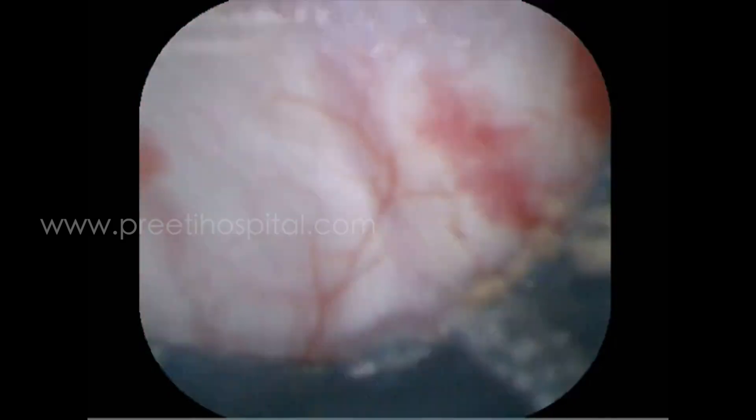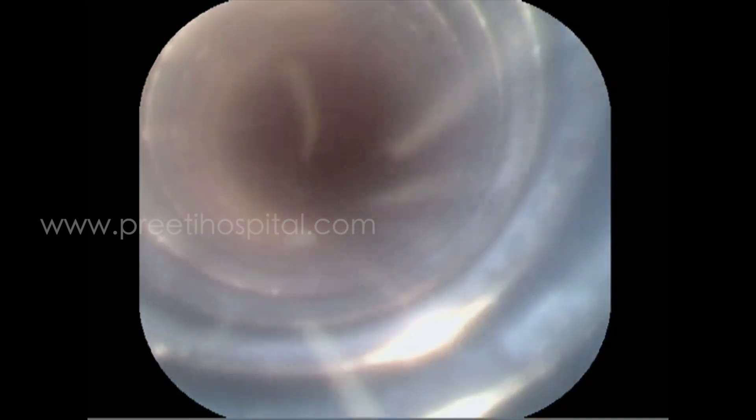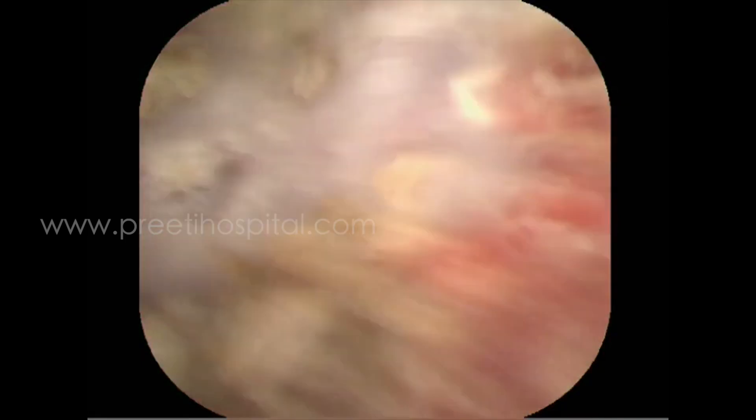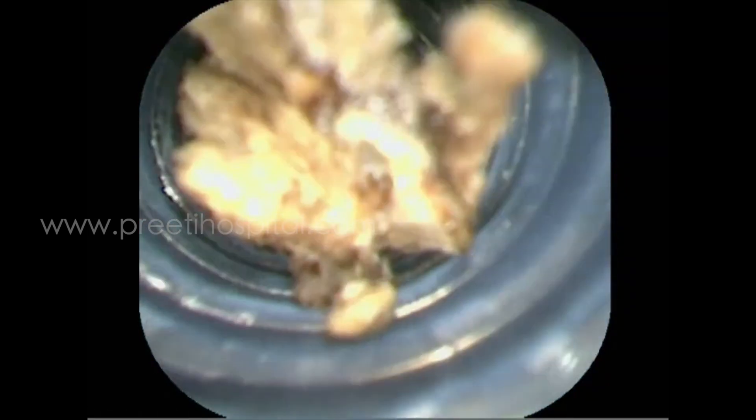Now see the luxury of the small powder being sucked out. At the end, two or three small fragments were there — these fragments are very small actually. But when they are sucked out through the access sheath, you feel very happy that on the table you are achieving a better and much better stone clearance.